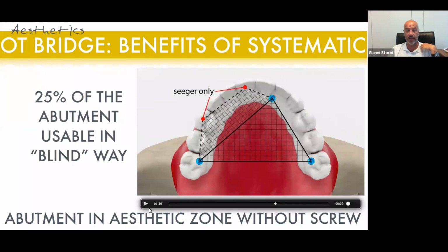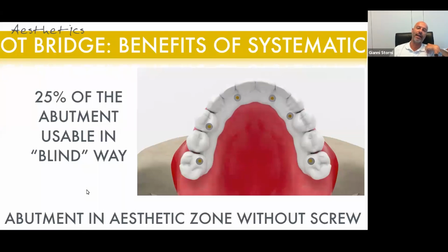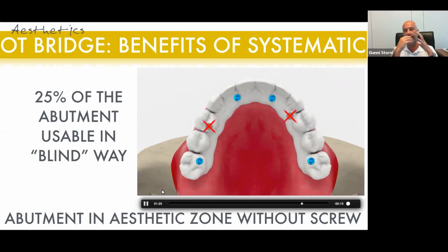This is very helpful and very important to give us one nice way and one good aesthetic, and no trouble of having one hole in the middle of the crown, and also one big MUA that gives us aesthetical problems if the patient smiles wide, you know, in the upper jaw mostly. So it's up to you.